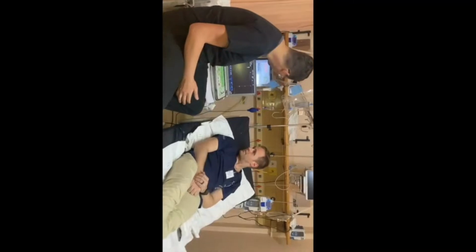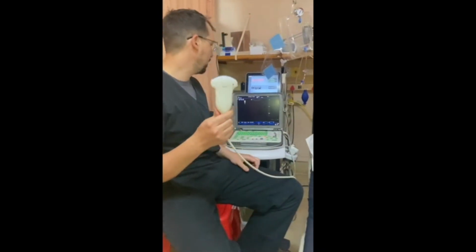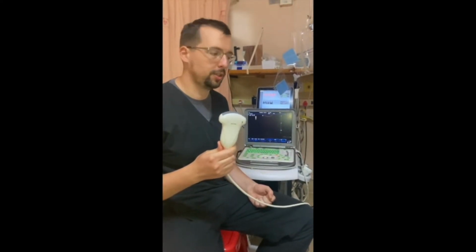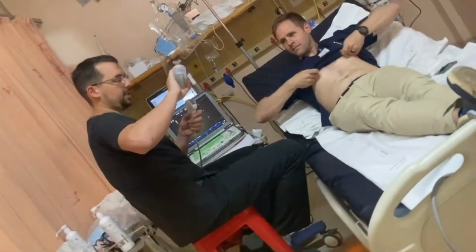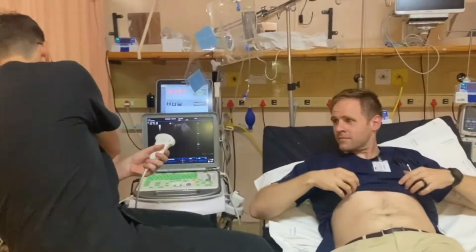The kind of probe that we select is a curvilinear probe. You can put it on an abdominal setting. And yeah, there's two views that you need. I'll show them on Don. Don, can you show us your abdomen? You will be able to see the videos of the slides themselves in a second.